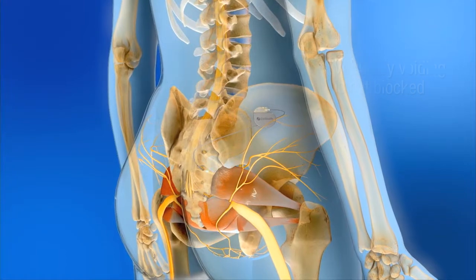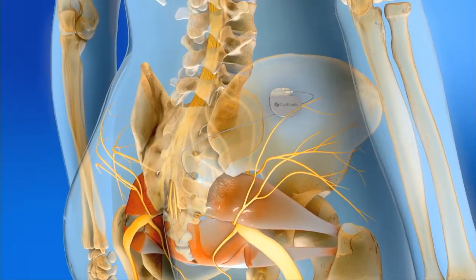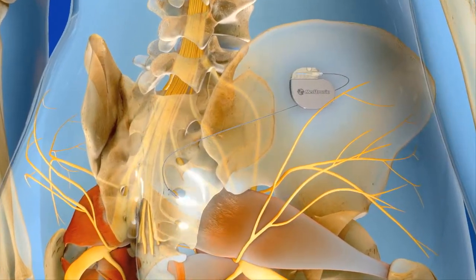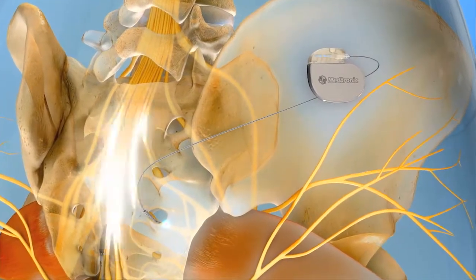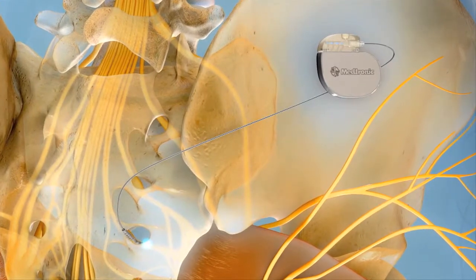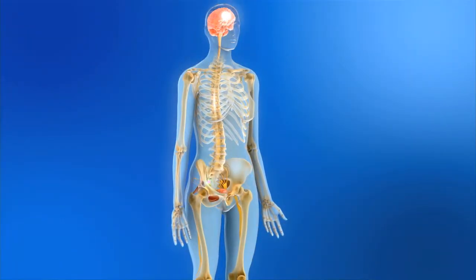Unlike other therapies that target the bladder, bladder regulation via sacral neuromodulation occurs without physically influencing the bladder or sphincter muscles. Medtronic Sacral Neuromodulation with the InterStim system is a minimally invasive treatment option for refractory OAB patients that provides continuous control through long-term therapy delivery.